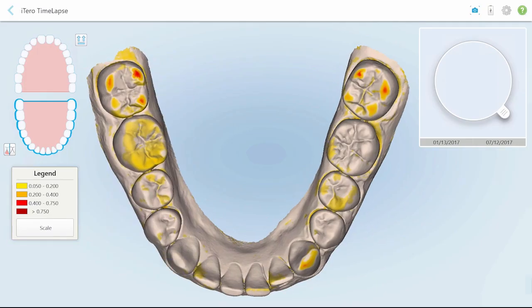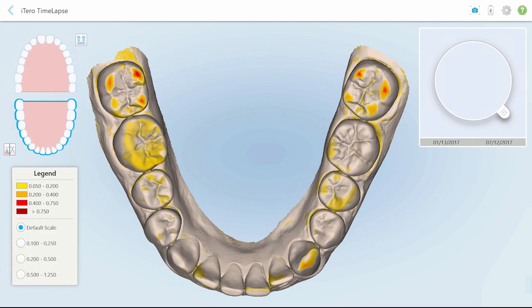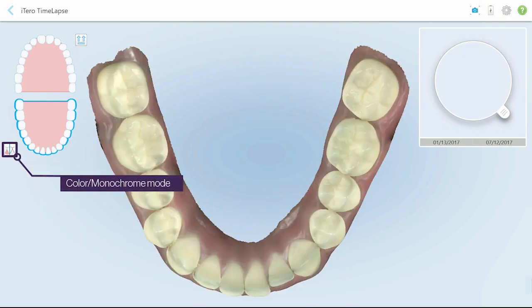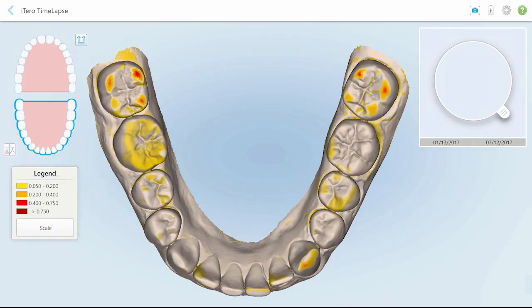The color legend represents the range of differences between the scans — the darker the color, the greater the difference. Tap Scale to adjust the color legend sensitivity and enhance anatomical changes.